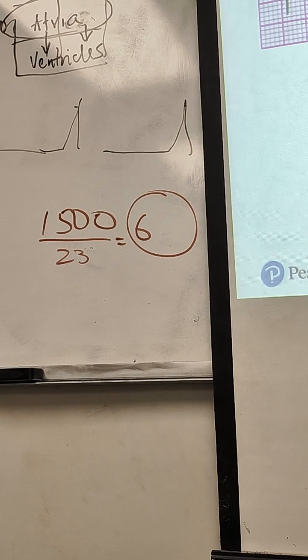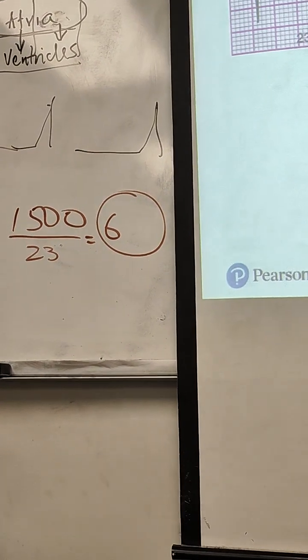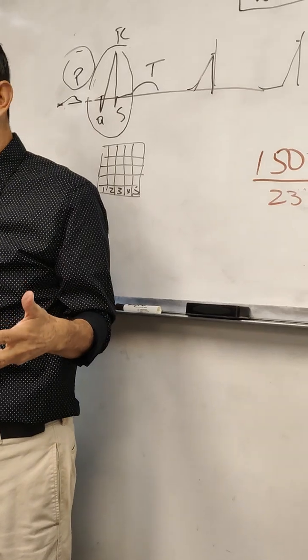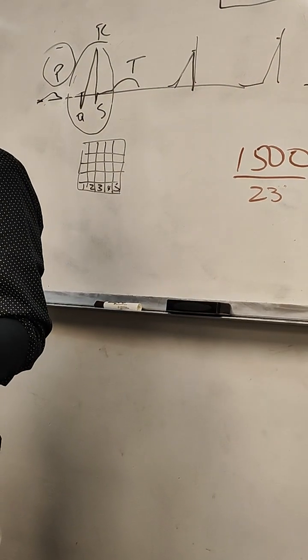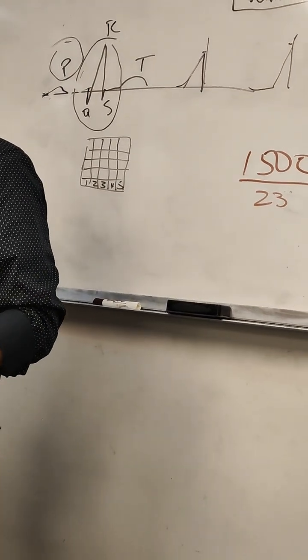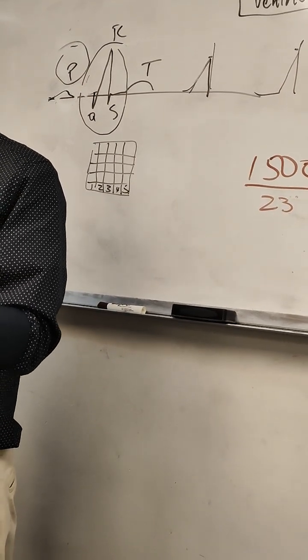So that's how you're going to answer your questions. Other than that, it will be impossible unless you have the EKG in front of you. But if you're not seeing it, they have to tell you. Otherwise, they will ask you using the memory method. Now you know that the memory method goes the big blocks and the small blocks. So that's what you have to immediately think about.